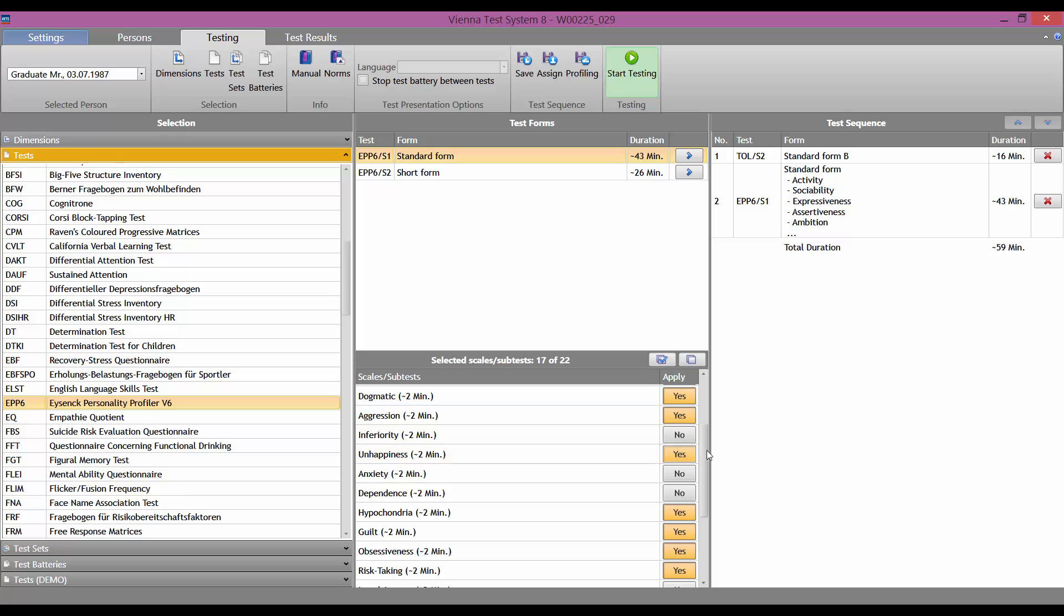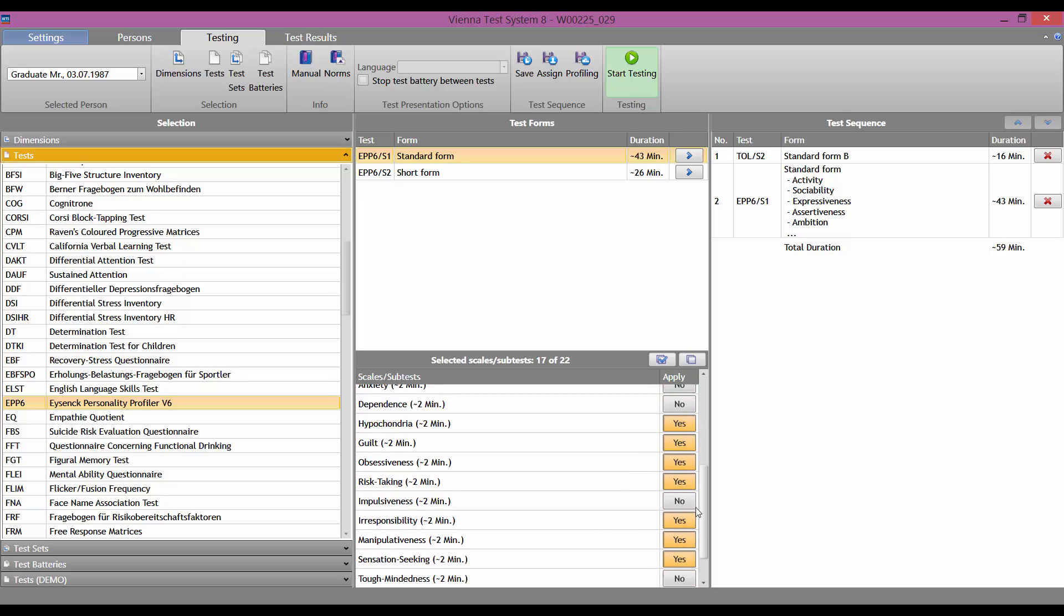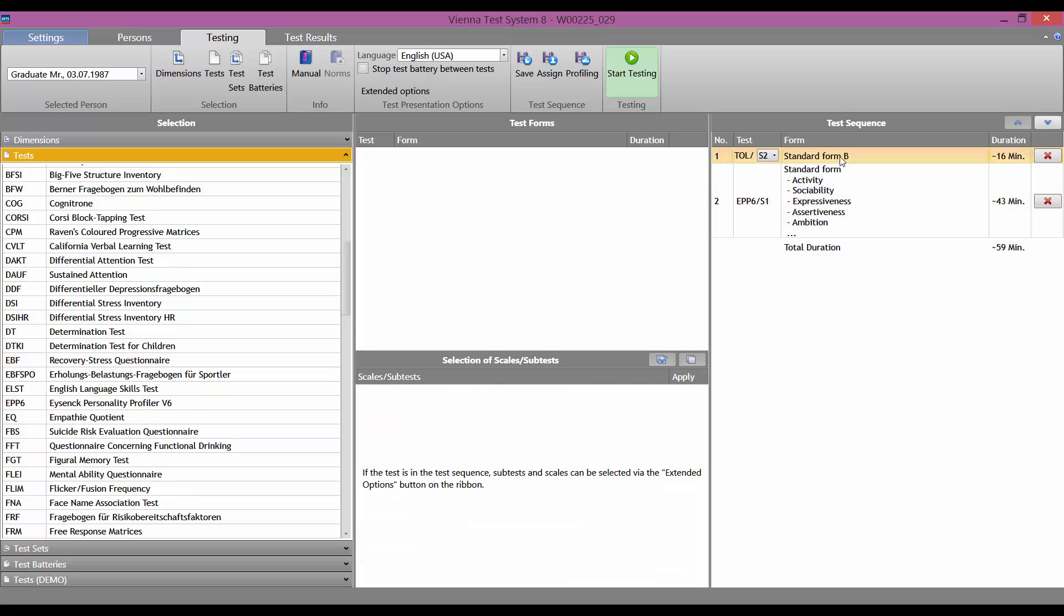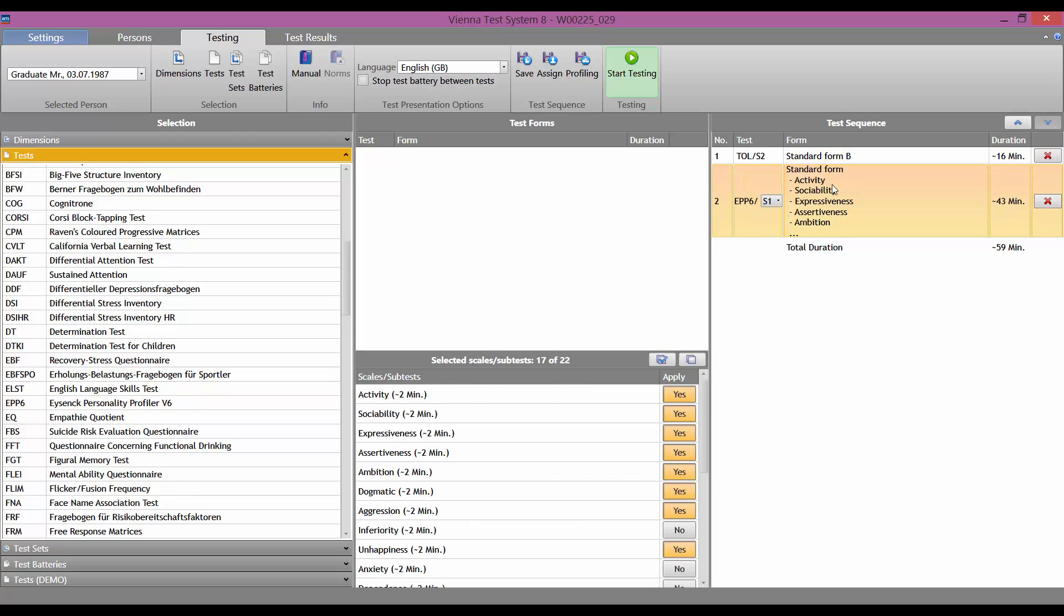Important. The special selection options for a test, if any, are only available in the center column. If you want to change a test in the right-hand column, click on the corresponding line, and you can then change the choices for this test.